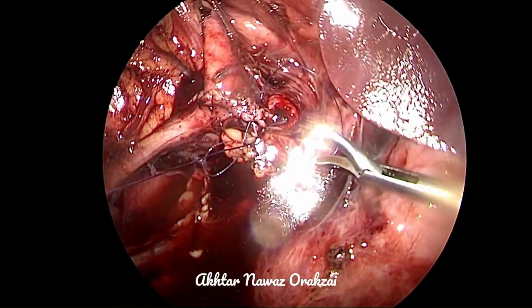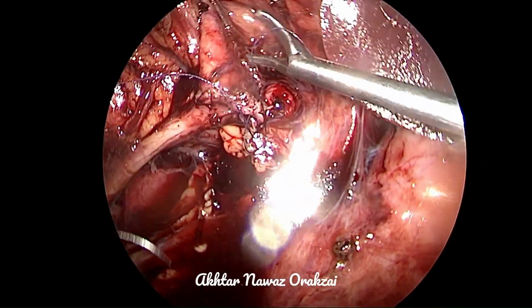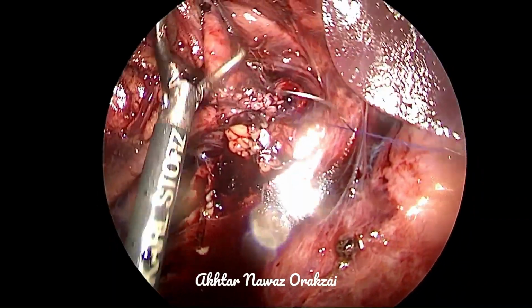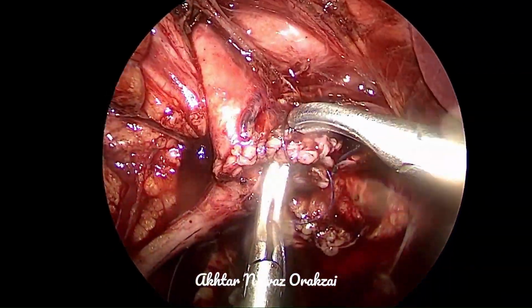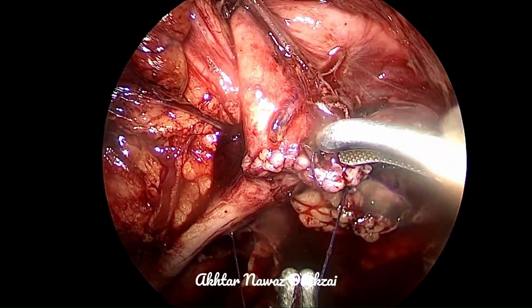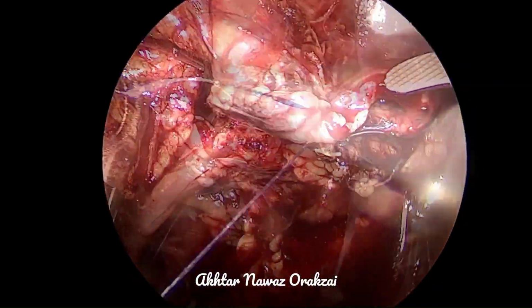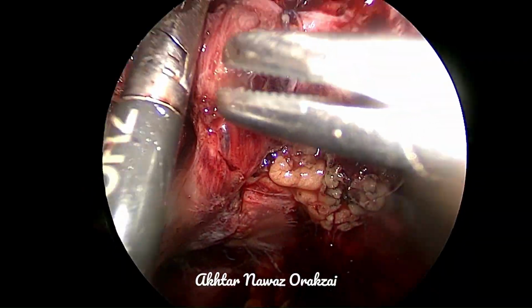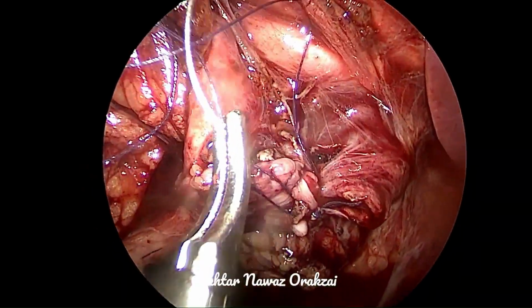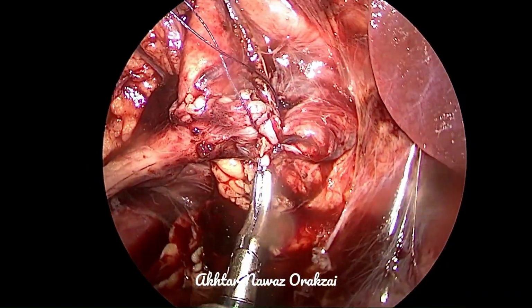So the area of the major anastomosis will not be having any adynamic segment, hopefully. So this is the apex of that segment of the ureter.